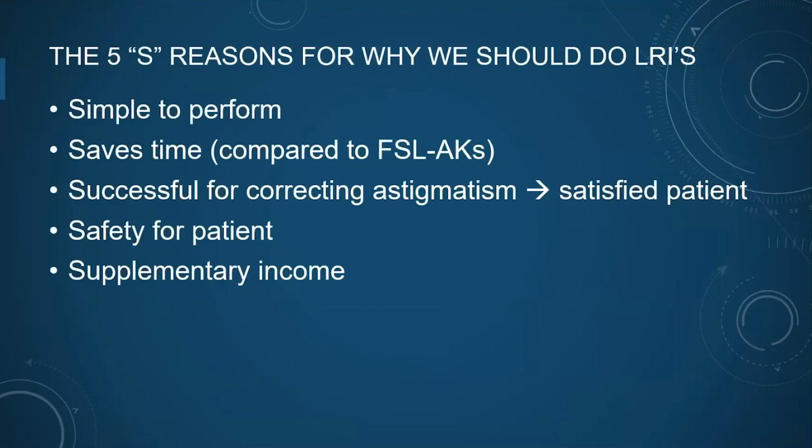So I wanted to come up with a catchy little mnemonic that you can remember. I'm going to call it the 5 S reasons for why we should do LRIs. And these are the 5 reasons: they're simple to perform, they save time, right? You don't have to go to the femtosecond laser.